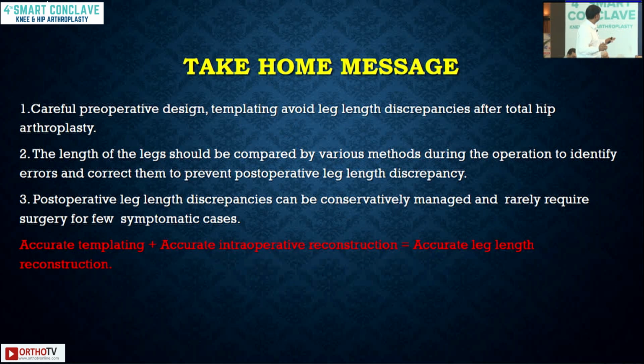So the take-home message is that careful preoperative designing and templating avoids limb length discrepancy, and the leg length should be compared by various methods during the surgery. Accurate templating plus accurate intraoperative reconstruction is equal to accurate leg length reconstruction. Thank you.